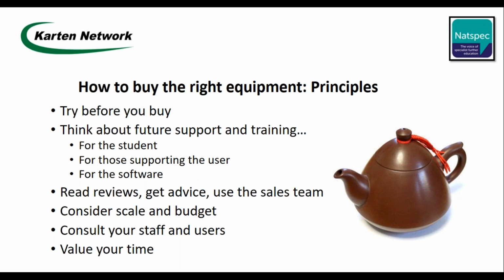You have to think about building this in right from the start, and also support for the software too, so that you can go back to the manufacturer and ask them for help on things, especially when you're looking at AAC devices or any kind of augmentative communication software. Then it's always worth going to a company that gives you that support if you need it.